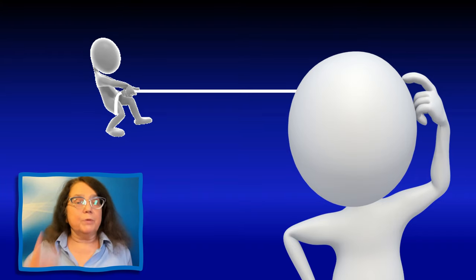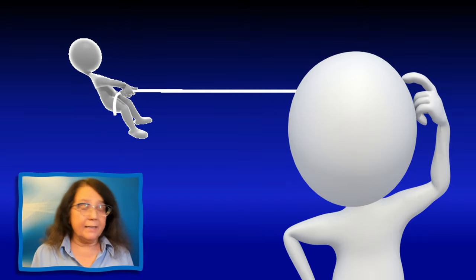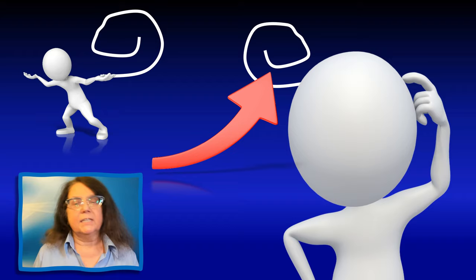What happens when we pull our hair? Well, at one point the hair will break, and when it breaks, it will coil at both ends. And these coiled ends tend to form different structures, and in trichoscopy, we will look at the distal ends of these parts of hairs which are left after the hair fracture. So what do we expect to see in a patient with trichotillomania in trichoscopy?